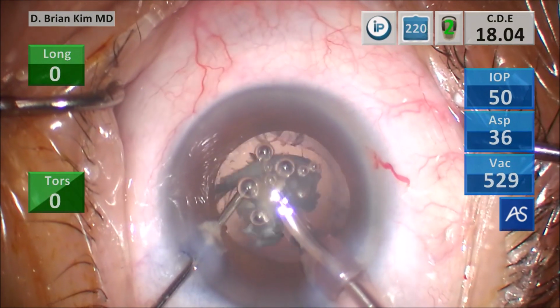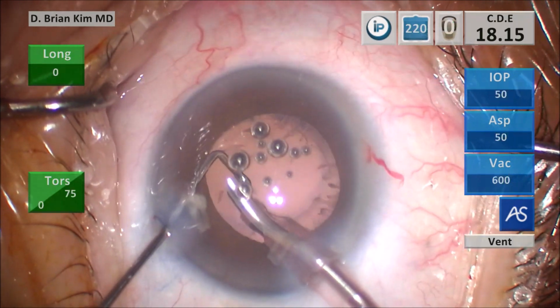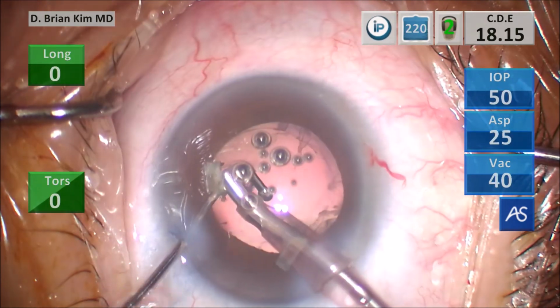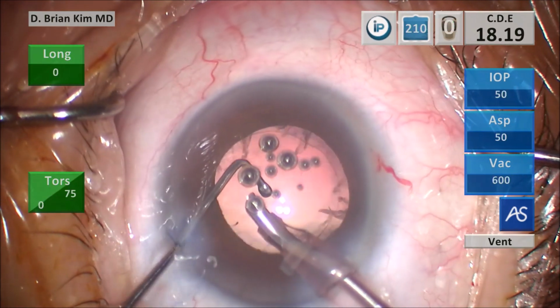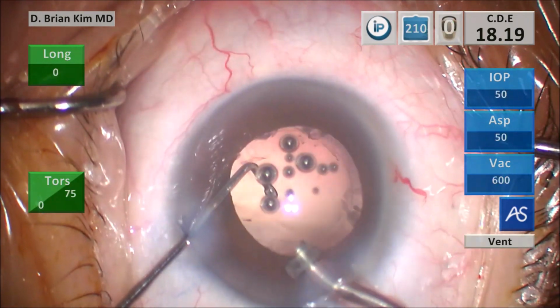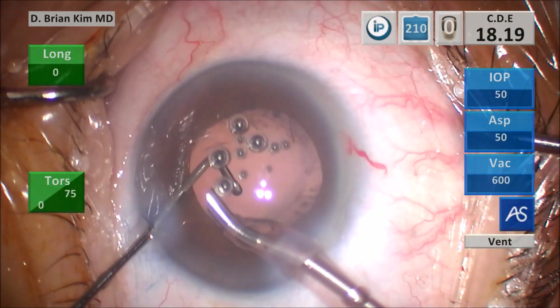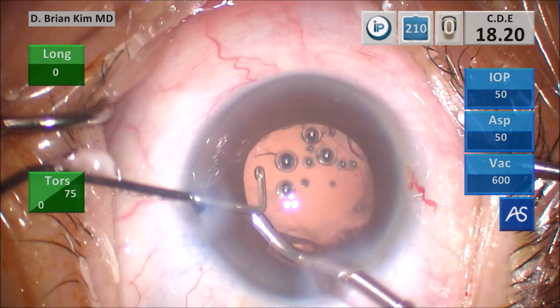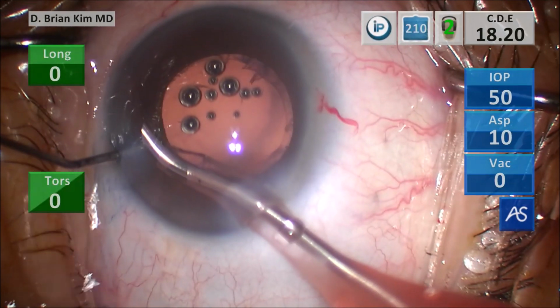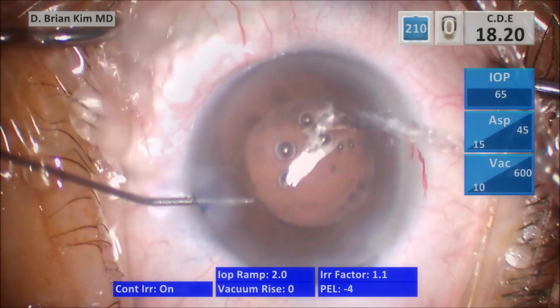And so I'm able to perform mechanical fracturing, minimize ultrasonic energy, and then vacuum. Remember, ultrasonic energy is one thing if you're using a lot of energy, but vacuum is the thing that, if you use it indiscriminately, you're removing the OVD that's coating the cornea. And so if you use a lot of vacuum, that's the other thing that can happen. That's why I always emphasize that mechanical fracturing can be performed without ultrasonic energy as well as without the vacuum. Ultrasonic energy, of course, goes without saying, can damage the cornea.